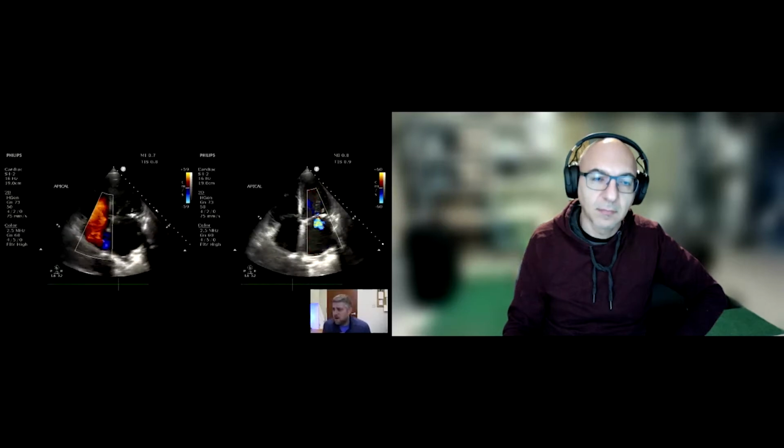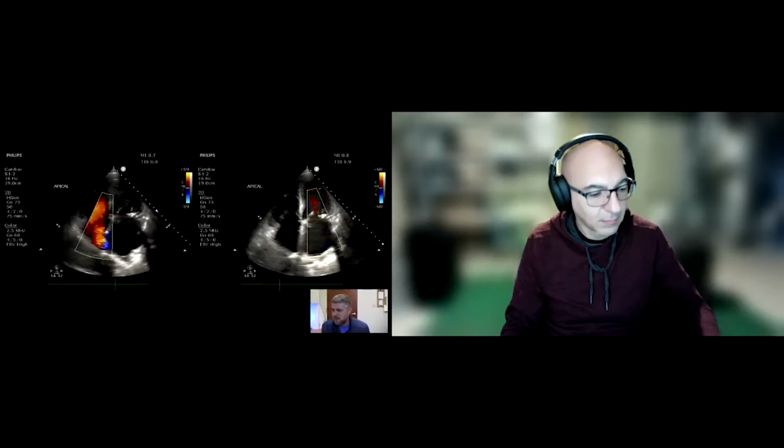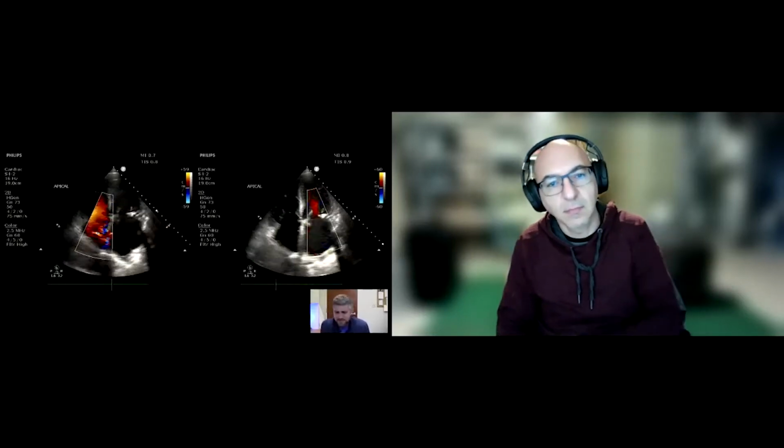And then the MR, we definitely see a very sizable plume that gets almost to the back wall. So I don't know if I'd go all the way to say severe, but it's certainly moderate MR in this patient. So I don't know, Z, does this do anything for you? Does this add anything to what we already know?